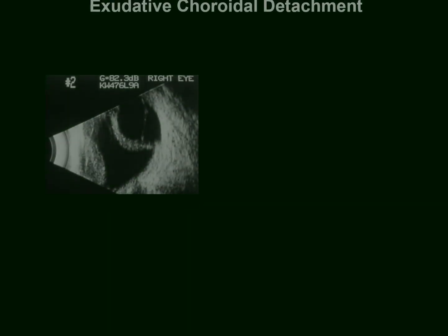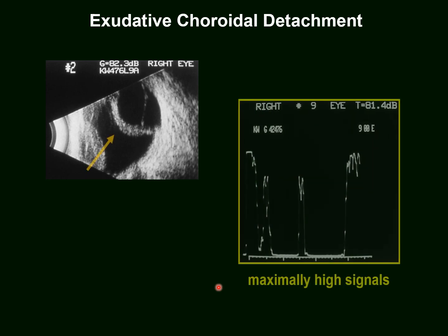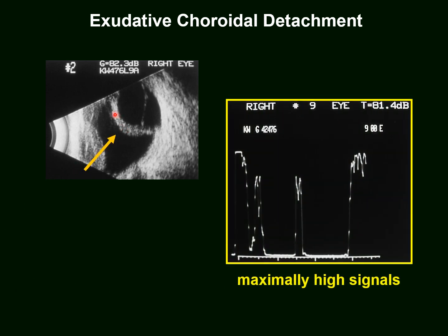That's large surfaces, and we see this in choroidal detachments. Classical pattern, steep rise away from the optic disc, here on both sides of the vitreous. And when we aim the beam now in this direction, it hits the retina on the surface of the detached choroid perpendicularly, but they are convex.